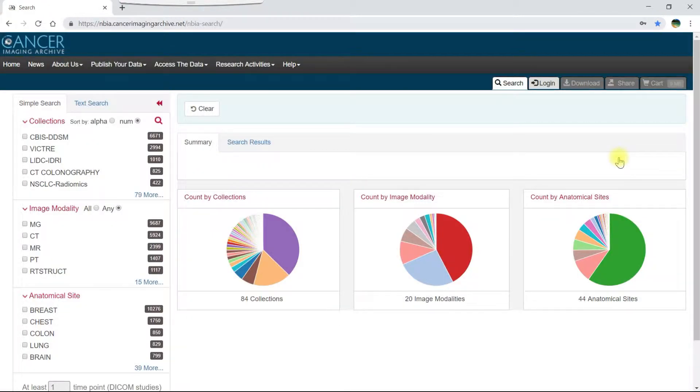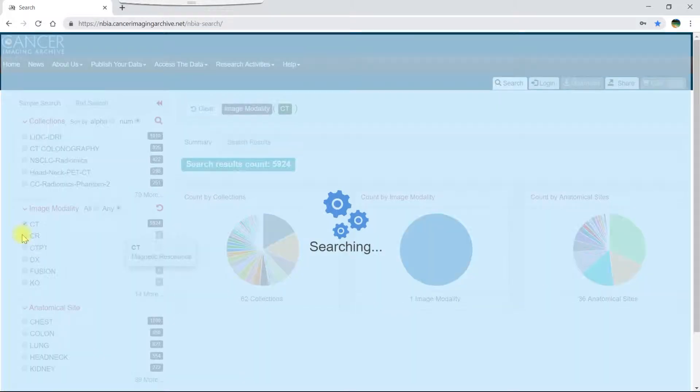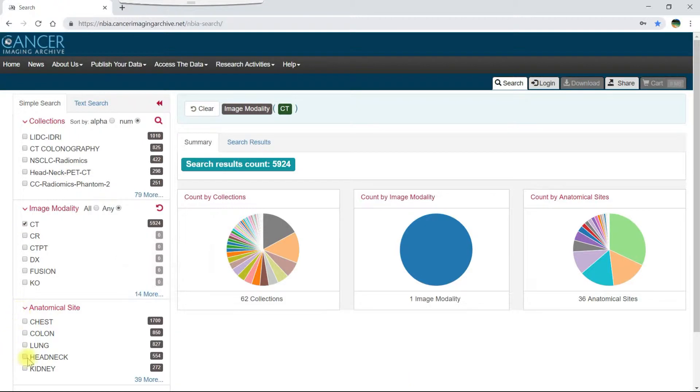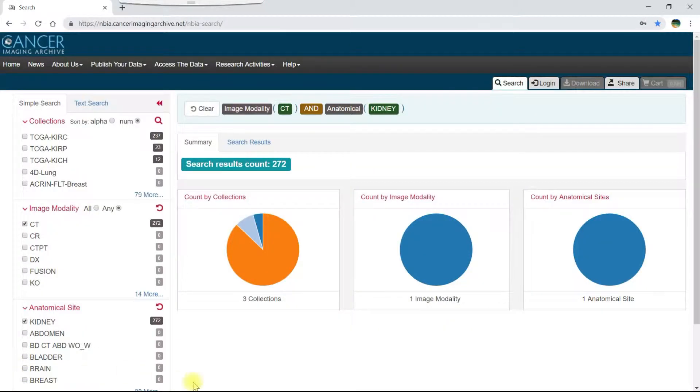Let's now search for kidney scans by selecting the box to the left of CT in the image modality filter and kidney in the anatomical site filter.